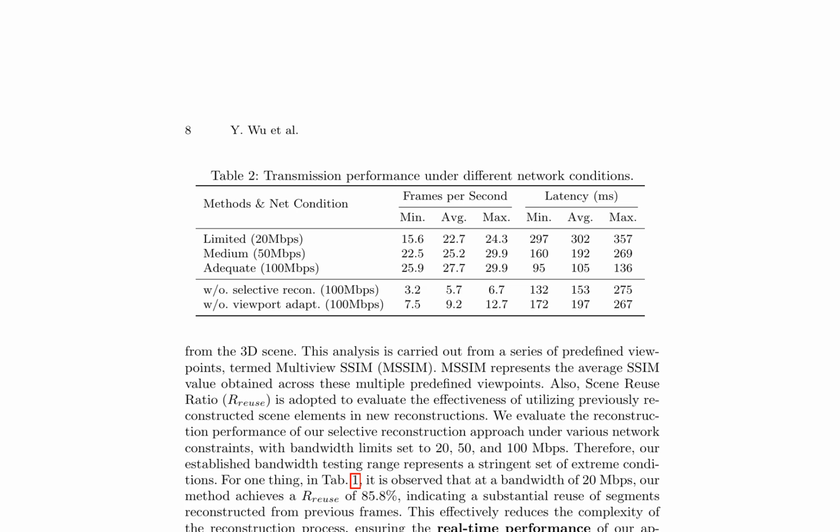Scene reuse ratio, RUS, is adopted to evaluate the effectiveness of utilizing previously reconstructed scene elements in new reconstructions. The results show that under limited network conditions, TeleOR achieves a high RUS, indicating substantial reuse of segments reconstructed from previous frames, thereby reducing the complexity of the reconstruction process.